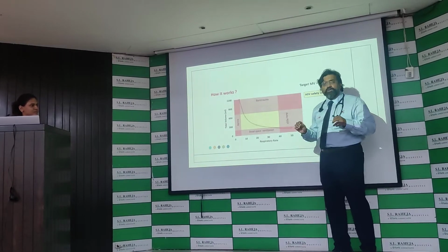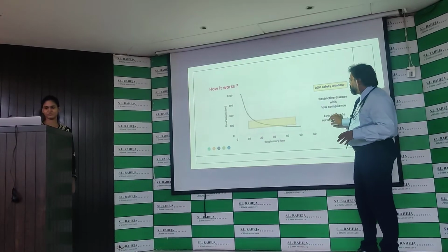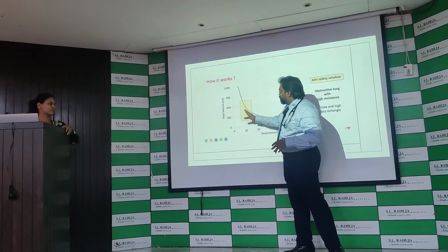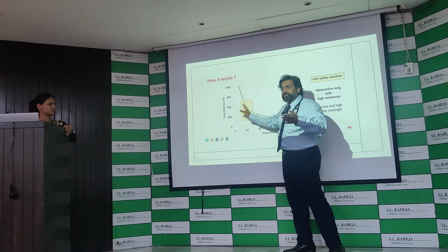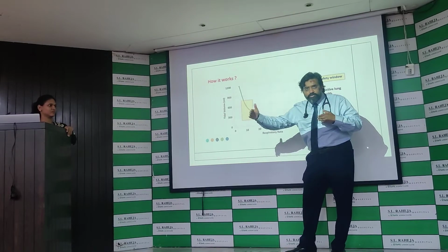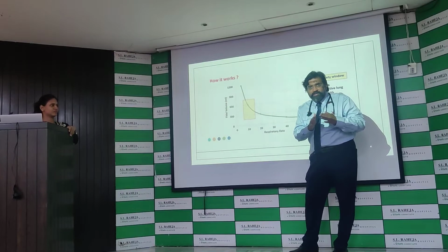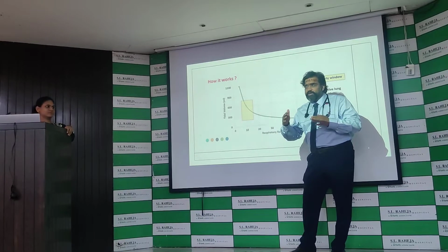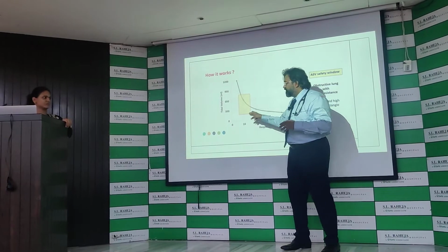If you have an obstructive airway, then the entire thing will be like this. Obstructive will be like this, where your tidal volume should be higher. It takes a call on giving more tidal volume but reducing the RR, because in obstructive airway disease, expiratory airflow has to be much higher. Expiration should be much longer. So it gives you lower respiratory rates and higher tidal volumes. When you do a COPD lung ventilation, you want the volumes to be slightly higher and the RR to be lower. So it is actually doing that.